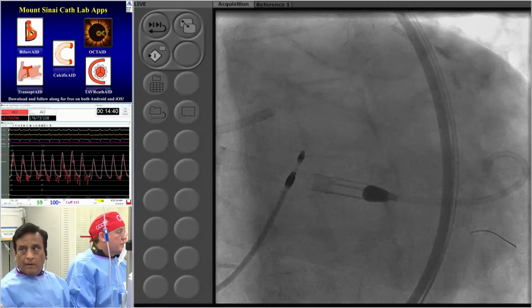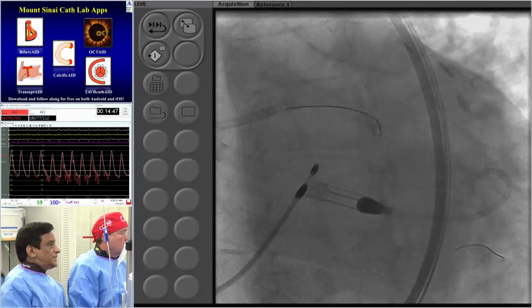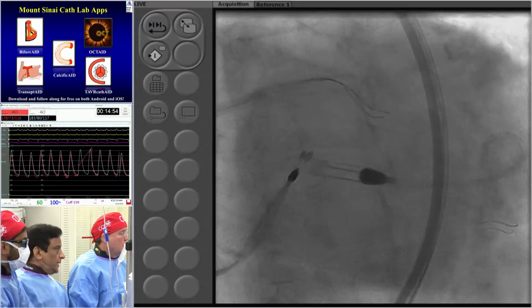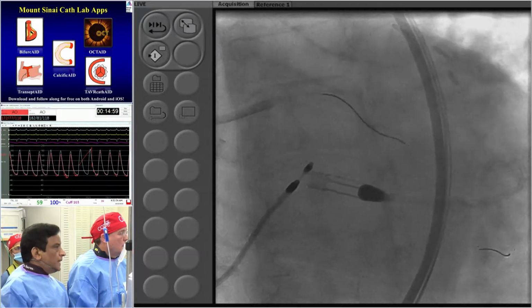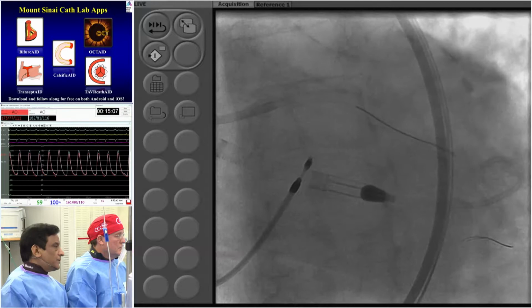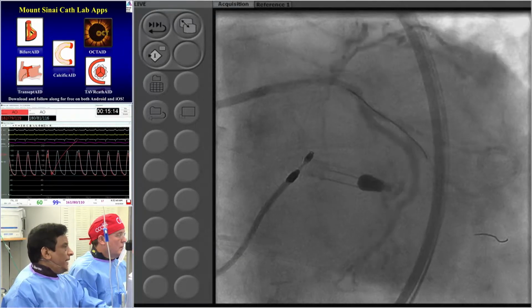What balloon do we have? Where's the fluoro? Did you go through that OM lesion? No, I didn't. We stopped before that. Because remember, there's no calcium in that area. So calcium is only in the left main and proximal circ. But why not go through that while you're there? Well, again, the question is, it's very angulated and it may create a problem in terms of wire bias, although many times it is towards our benefit. But let's see now, if there is a problem in advancing, you can always go.